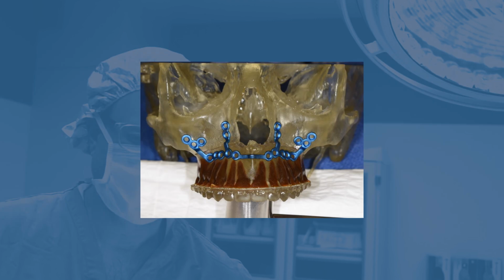So 3D planning, it's amazing, and it moves beyond just thinking about the bite. The bite's important, but we really want to ultimately understand where the bones will end up, and we want to put those bones in the best place to optimize aesthetics, to improve the TMJ function, to improve the airway. And we have tools, 3D printed plates, cutting guides that will really help us establish that.